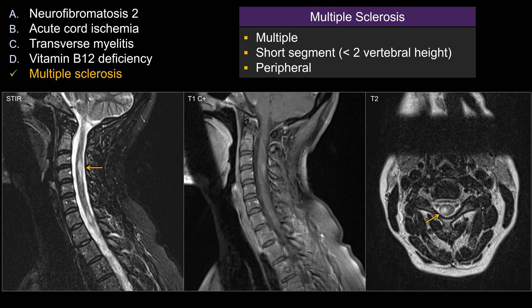In addition, you can see that one of the lesions shows enhancement, so the patient has evidence of active or recent demyelination. In fact, you can see a second lesion that also shows enhancement, which is a little harder to see on the periphery of the image — right at the junction between the pons and medulla. So the patient has multiple enhancing lesions, indicating active or recent demyelination.